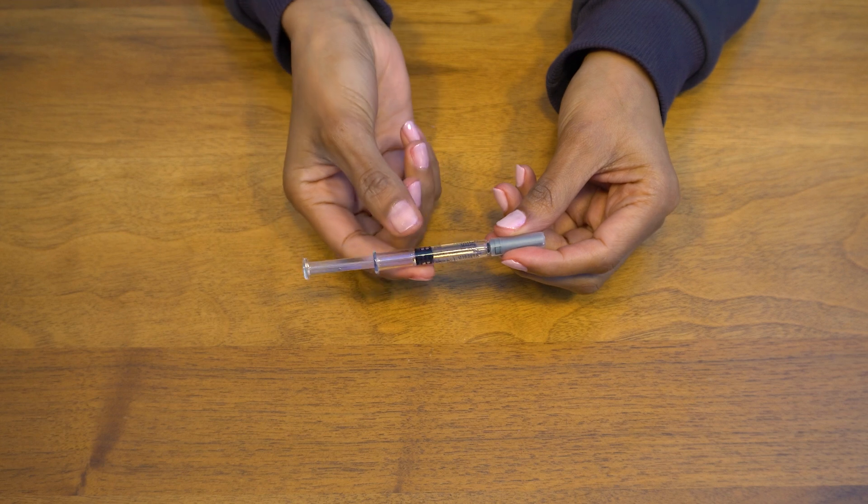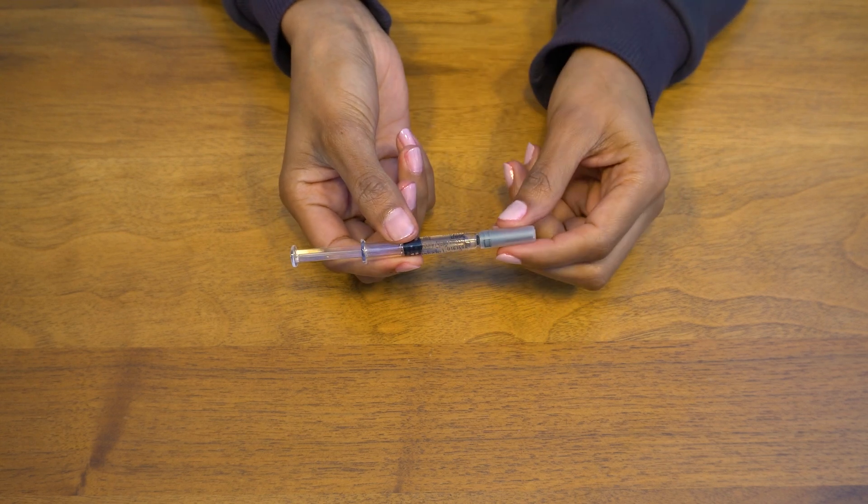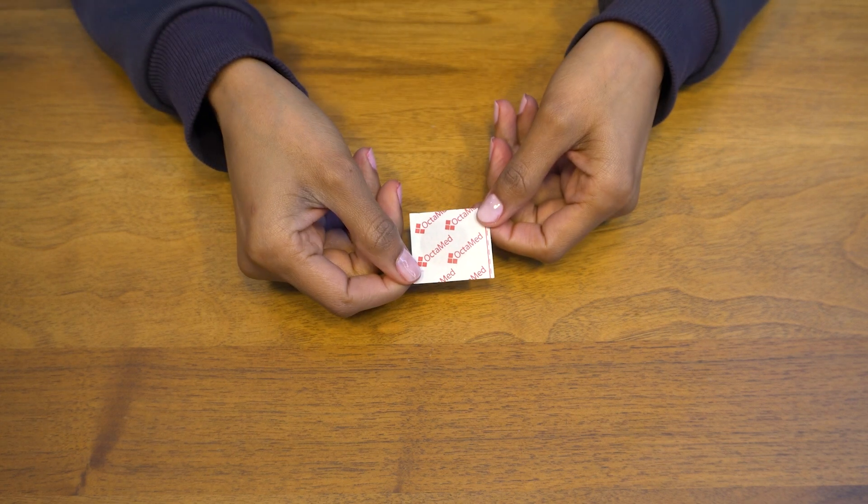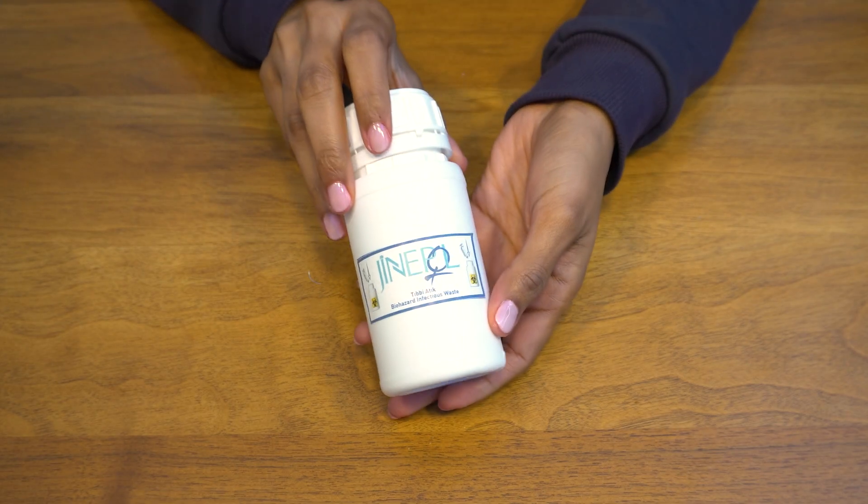Preparation. You'll need the following supplies: an Orgolutran Pre-Filled Syringe, an Alcohol Swab, a Band-Aid, and a Sharp Disposal Container.